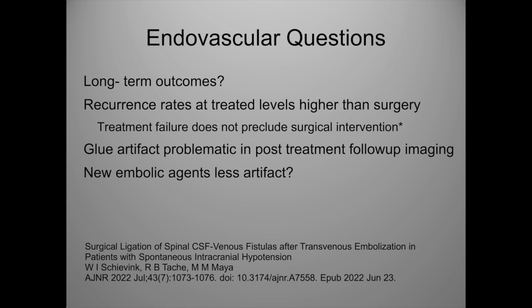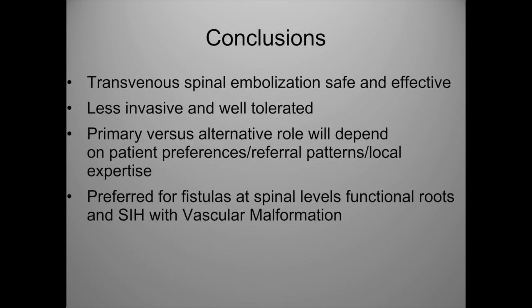So we'll see. My conclusion is that this is a safe and effective way to treat CSF venous fistula, well tolerated. The practice will depend on where you are, what your expertise level is, and the patient preference, and there are certain areas where one is definitely preferred over the other in certain subsets of patients.